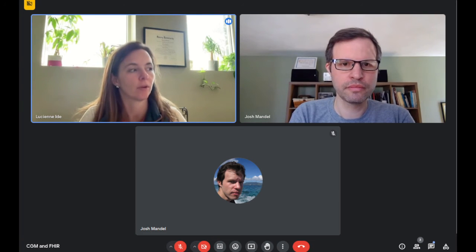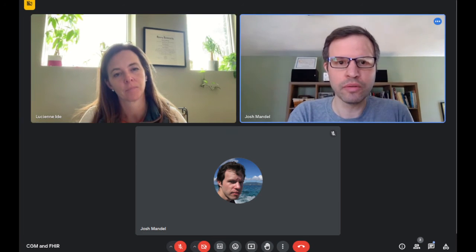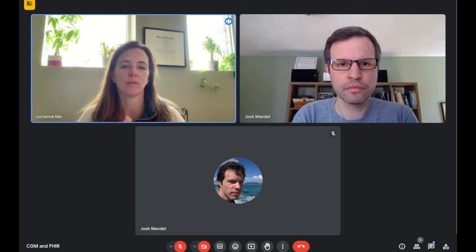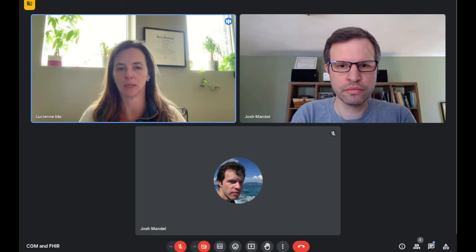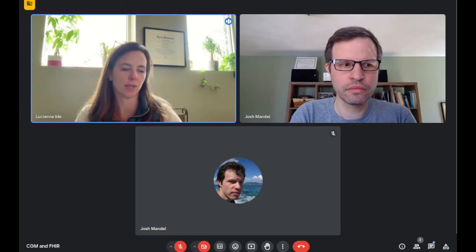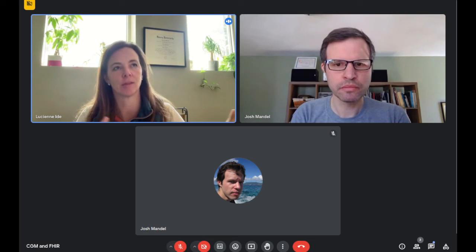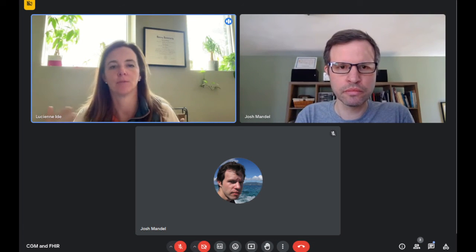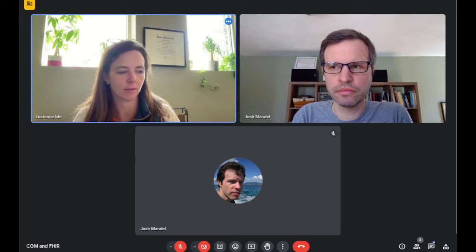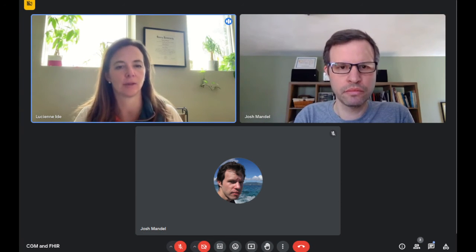So then there's one more thing that we're very interested in, but I don't know if it's come up in your conversations, called glycemic risk index. No. People will refer to it as GRI. This is still a bit of an academic exercise. It hasn't made it into the practice guidelines yet, but people will say, first we managed diabetes with hemoglobin A1C, which was a 90-day average and didn't tell you anything about the spikes. Then we got CGM data, and people have focused on time in range. And now they're saying, but you know what? Time in range doesn't really tell you, for a patient who's 60% in range, what's happening the other 40%?